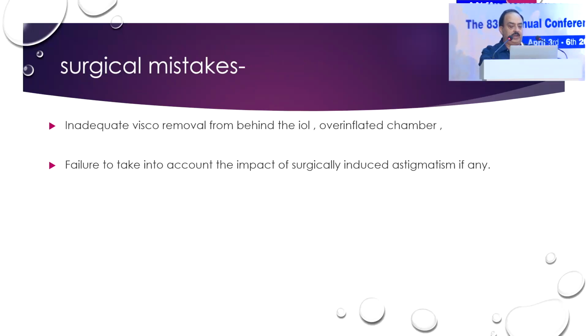Surgical mistakes: inadequate visco removal from behind the lens, and an overinflated chamber. What happens if you have an overinflated chamber?